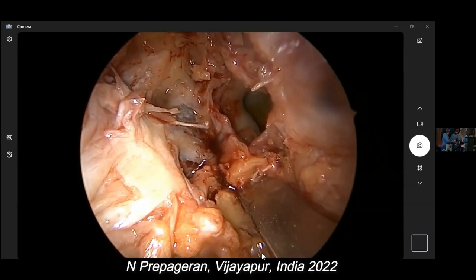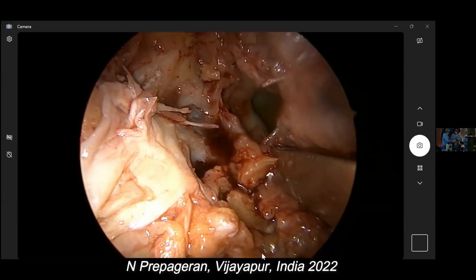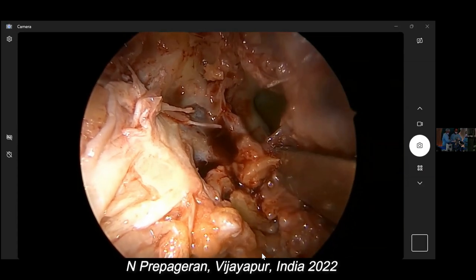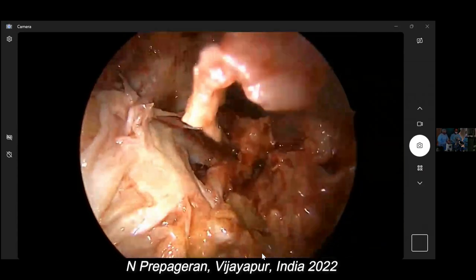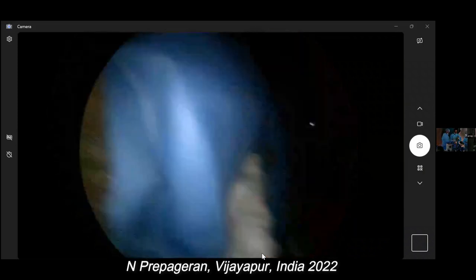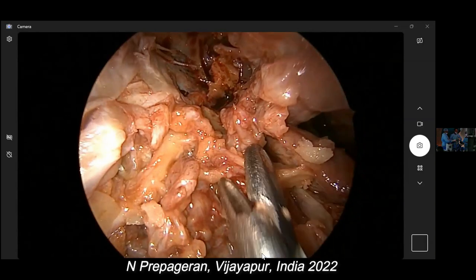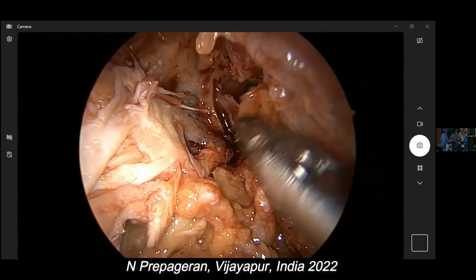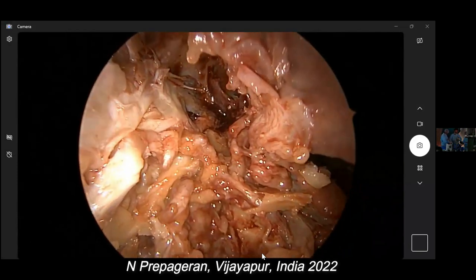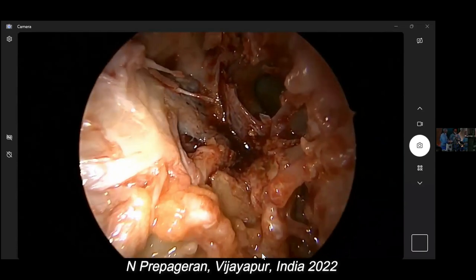Okay, let's clap for Shashi again for doing such a wonderful sculpturing job. So you can do part-time chiseling for the statues, I think. Okay, so now with this bone, Shashi, we should be... Hard work. We should be able to see Meckel's cave.